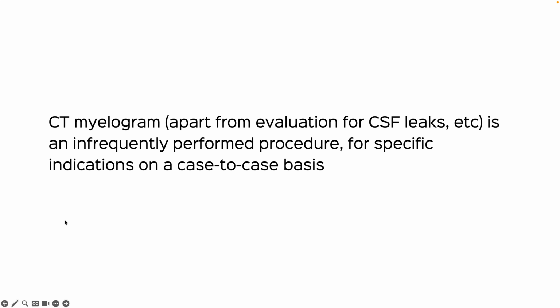So CT myelogram, apart from evaluation for CSF leaks, is an infrequently performed procedure, but it is still done, and so we should know still how to do it. And it's best done by injecting under CT guidance because that's very simple and straightforward, and we do it for specific indications on a case-to-case basis.